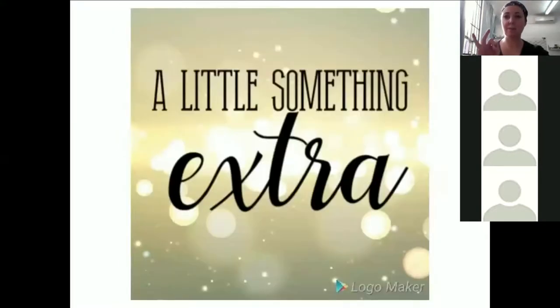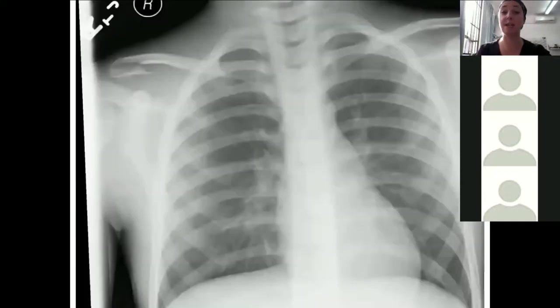So we chatted about airway, breathing, circulation, diaphragm, and then you want to have a look and see, is there something extra going on? Something else, aside from what we've already looked at, that you want to mention. So on this x-ray, trachea central, your lung fields are nice and clear, your cardiothoracic ratio is normal, your diaphragms are beautiful, but hang on, have a look at your right-hand side clavicle. And can you see that you've got a right clavicular fracture? So you want to have a look at all your bones and have a look and see what else is going on and is there something extra that you need to spot.